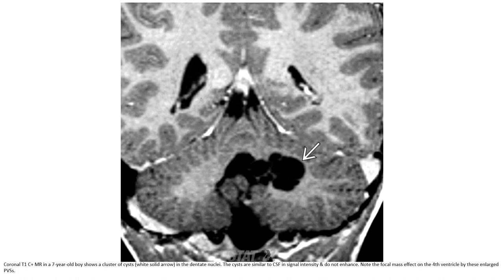T1 image in a seven-year-old boy shows a cluster of cysts in the putamen nucleus. The cysts are similar to CSF in signal intensity and do not enhance. Note the focal mass effect on the adjacent ventricle, which is a finding seen in large PVS.